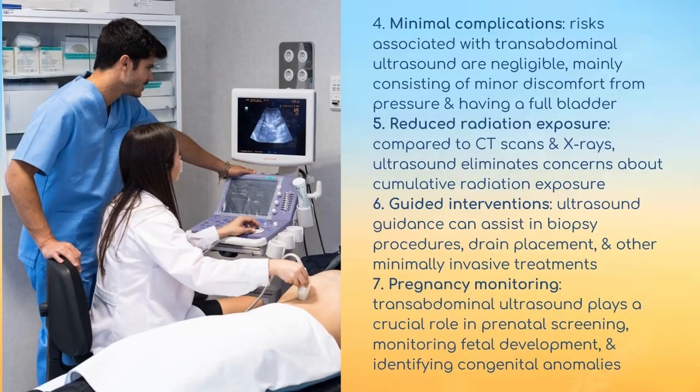Minimal complications. There's also very low risk associated with a transabdominal ultrasound. Complications are negligible, mainly consisting of minor discomfort from pressure and having a full bladder. Reduced radiation exposure compared to CAT scan and X-ray. Ultrasound eliminates concerns about cumulative radiation exposure. Guided interventions, such as ultrasound guidance for biopsy procedures, drain placement, and other minimally invasive treatments, and pregnancy monitoring. Transabdominal ultrasound plays a crucial role in prenatal screening, monitoring fetal development, and identifying congenital anomalies.